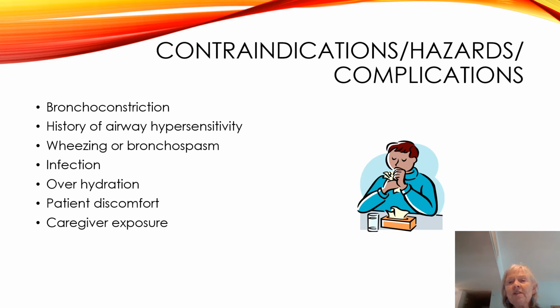Overhydration, the question comes up is how can you overhydrate a patient or overhydrate anything that you're doing with these patients? Well, if you go back and think about humidity, when we heat humidity and raise the temperature of the gas, if we don't watch it, that temperature can go up way too high, at which point in time now we're delivering too much humidity to this patient and we're going to overhydrate their secretions.